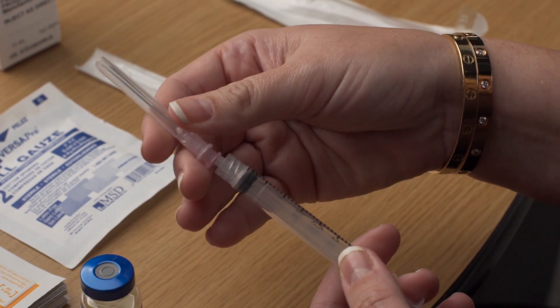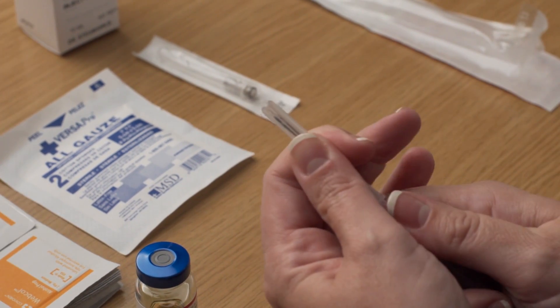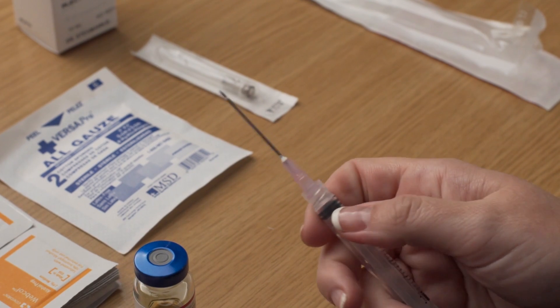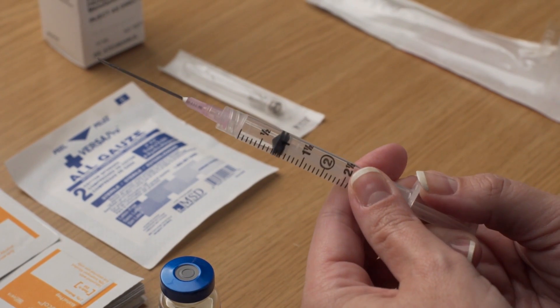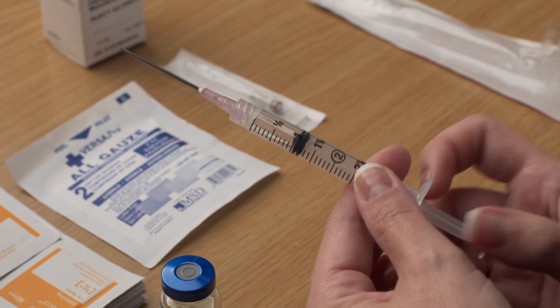Some kits include the drawing needle already attached, while others are separate. If separate, attach the 18 gauge, one and a half inch drawing needle with a twisting motion. Carefully pull or twist off the needle cap. Draw air into the syringe by pulling back the plunger to the milliliter marking that you have been instructed to take.